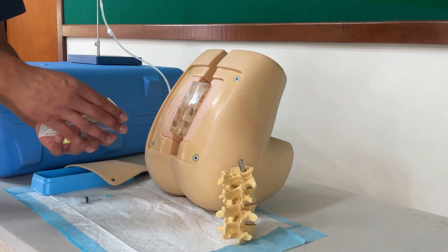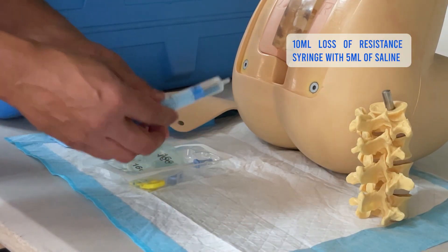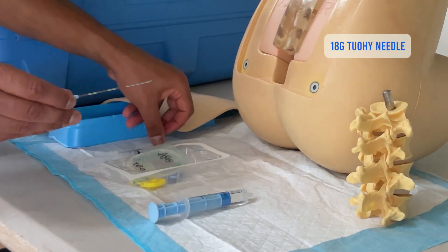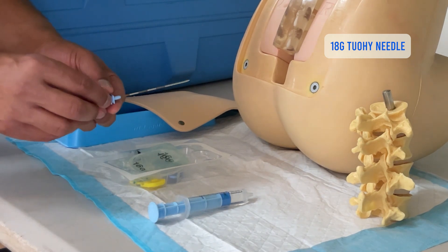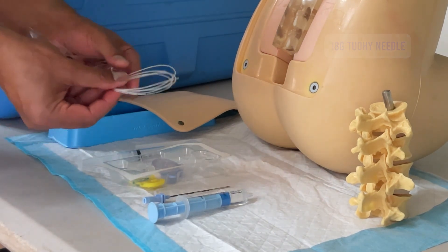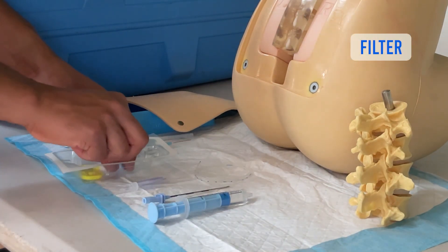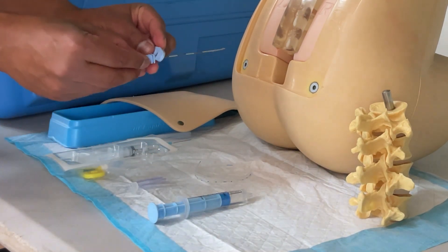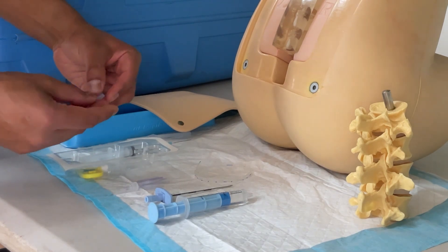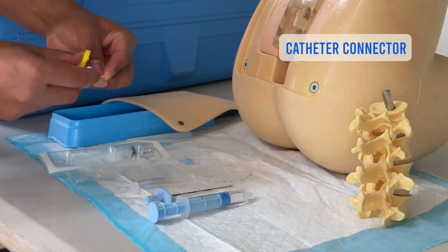This kit is an epidural mini pack by Portex. I have a loss of resistance syringe and I put about 4 or 5 ml of saline into that. I've got the epidural Tuohy needle — this is a 16 gauge, but often I'll use an 18 gauge for most procedures; I've pretty much never used a 16 gauge, 18 gauge is absolutely fine. It comes with an epidural catheter, a filter, and a wing which I apply to the needle for better traction, plus a threading guide and a locking mechanism.